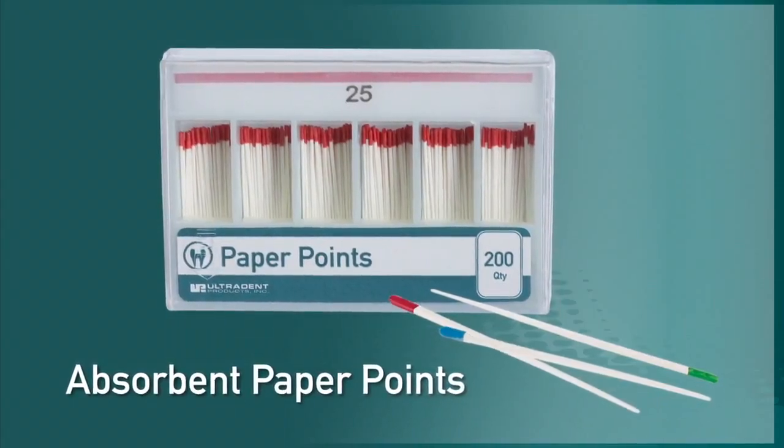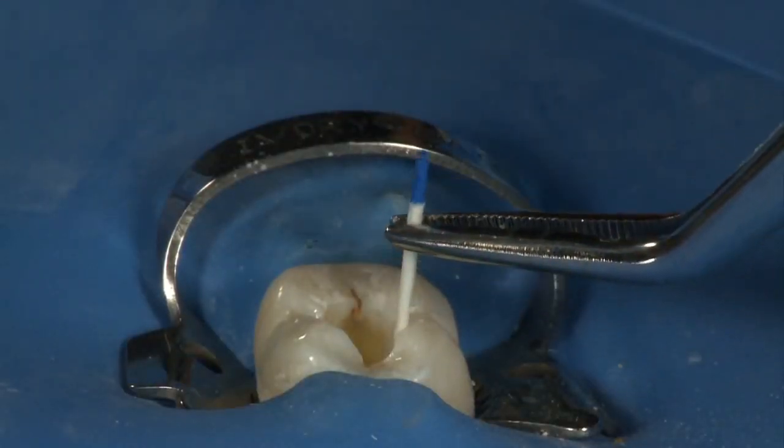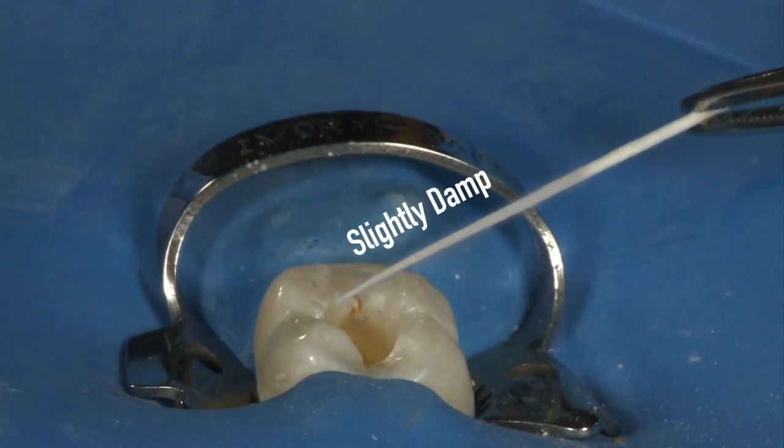and blot out the canals using 1 to 2 paper points. Because we will be sealing the canal with EndoRes, it is not necessary to desiccate the canal. Leaving the canal slightly damp will provide the best environment for EndoRes to penetrate into the tubules.